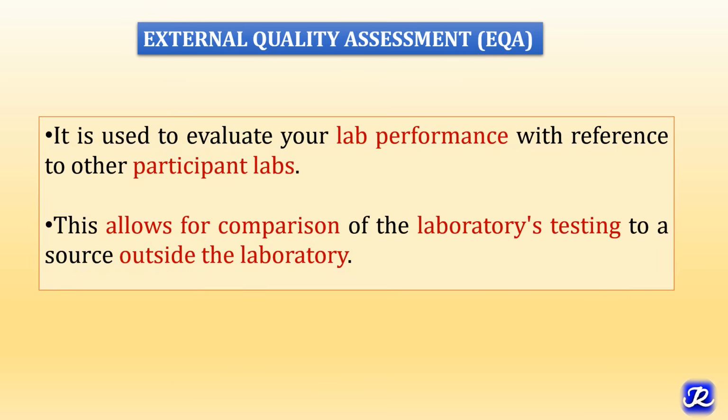External quality control, also called external quality assessment or proficiency testing, is done by some external outside agency, and it is used to evaluate your lab's performance with reference to other participant labs. It is for inter-laboratory comparisons. For example, if I am getting results of a particular test in my lab, are they comparable with the results of other labs? If I want to test that, I have to use the external quality assessment scheme. So this system allows for comparison of a laboratory's testing to a source outside the laboratory.